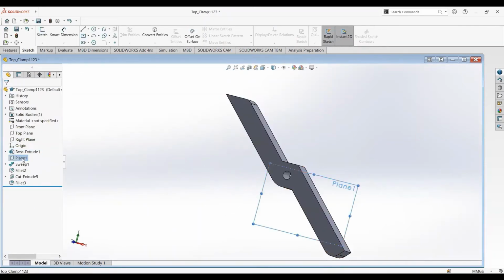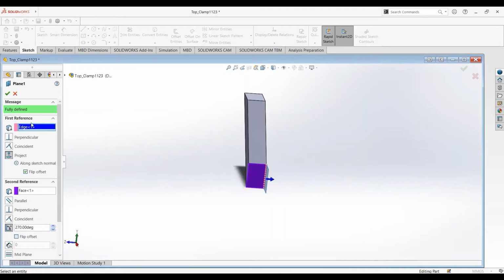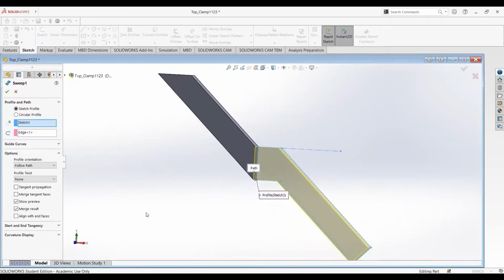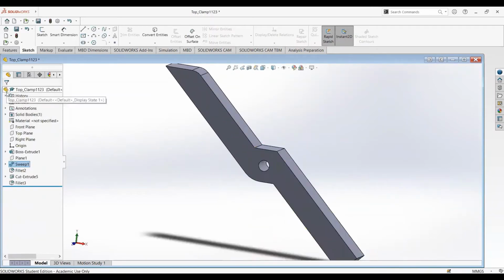Okay, after that, we used this reference plane and we put edge 1, face 1 right here because we're going to use sweep. And I'm going to go through the feature right here. So you can see this profile and path. The sketch, the blue part, is what you wish to use as a profile. That's why it says profile sketch. And the pink part, the edge, is what you use as the path for the sweep, right here. And after that, it looks like this.